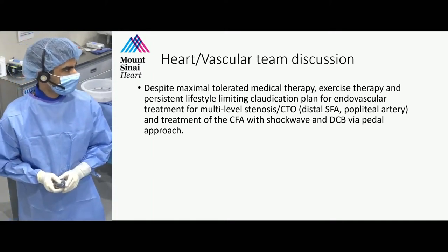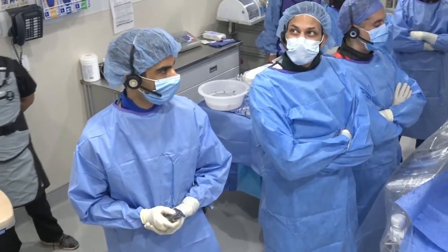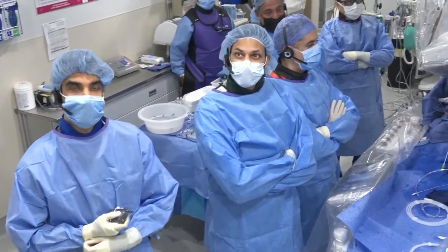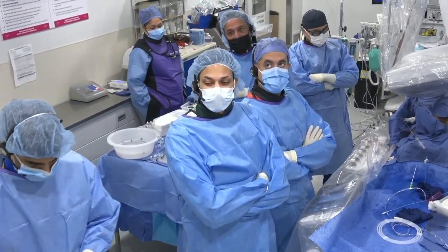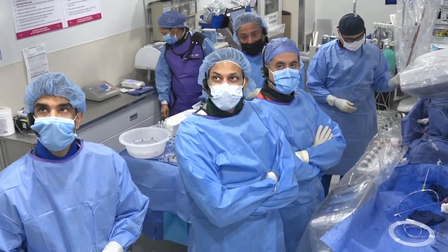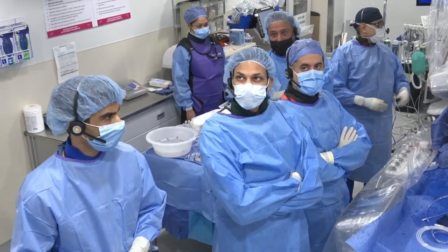This is one of those cases where we went through our thought process, and obviously, I'm glad that the two of you are here to help us. I think she's gotten so symptomatic because of her multi-level disease. I mean, she has SFA disease. She has a very minimal profunda, as you saw. She has no internal iliac giving collaterals.